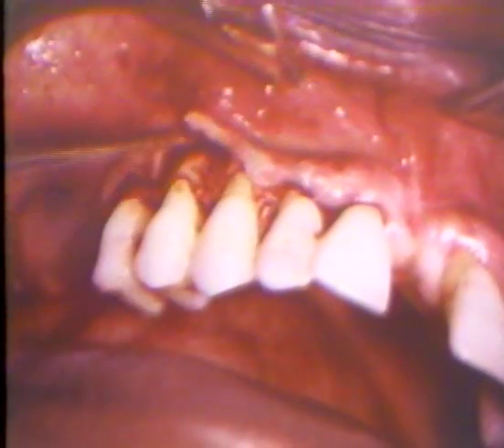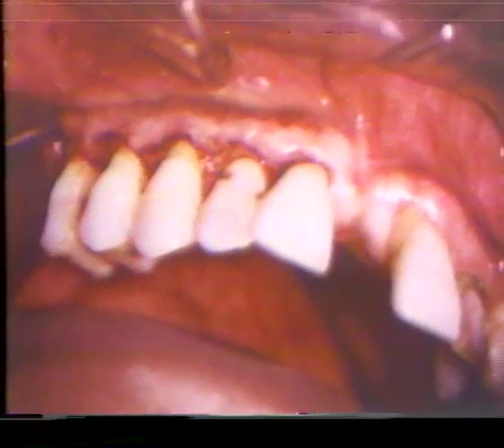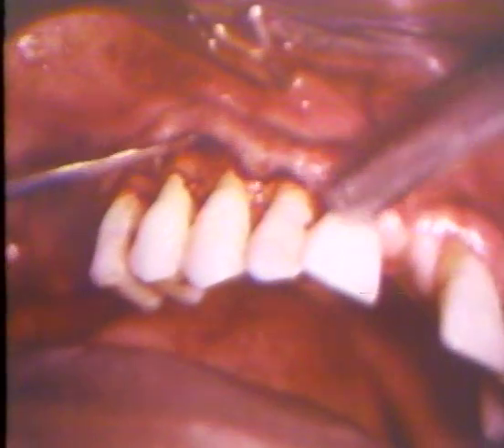The buccal flap is now going to be reflected. This is a full thickness flap reflected by a periosteal elevator. It will permit access to the underlying osseous tissue and at the same time will retain the zone of attached gingiva. Reflecting the flap enables the clinician to see the pattern of the underlying alveolar bone.